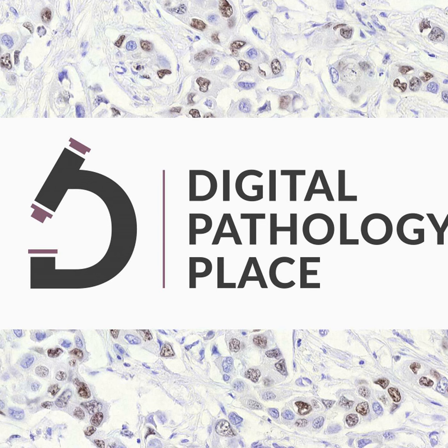Whole slide imaging, this question we can probably do very fast, because everybody interested in digital pathology knows what whole slide imaging is. This is the digitization of glass slides, generating a two-dimensional digital image. And here is an interesting part: two-dimensional.